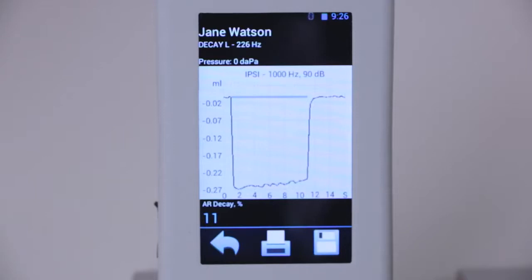In cases where the decay percent is above 50%, it tells us about non-oncological pathologies of the retrocochlear part of the auditory system. And if in your patient the decay is more than 90%, it is very suspicious for an oncopathology, for example, vestibular schwannoma.